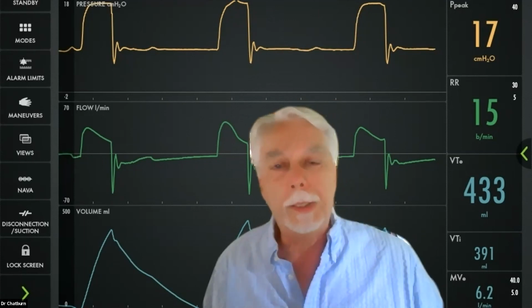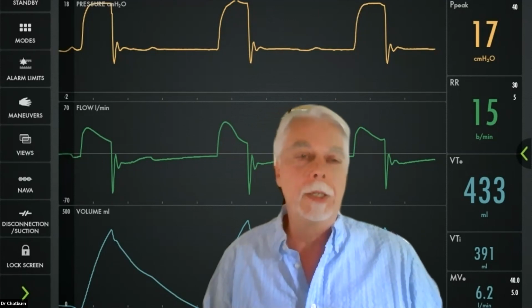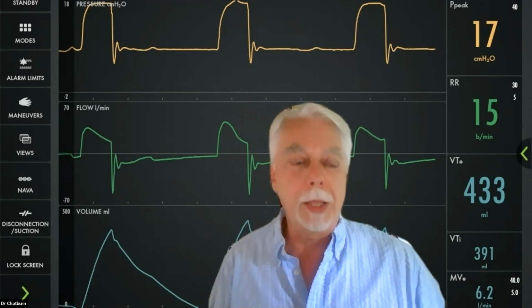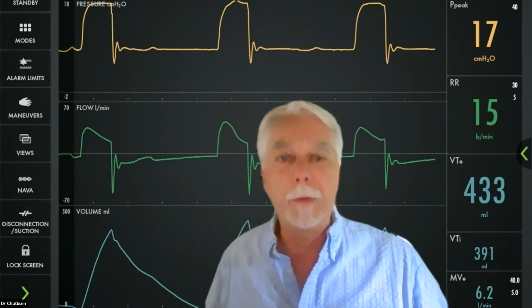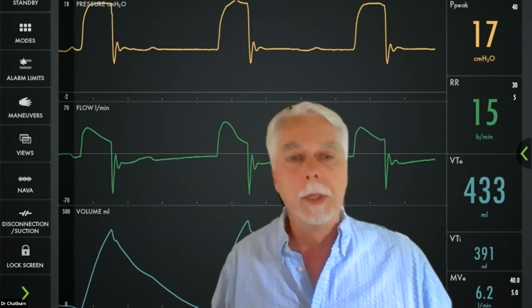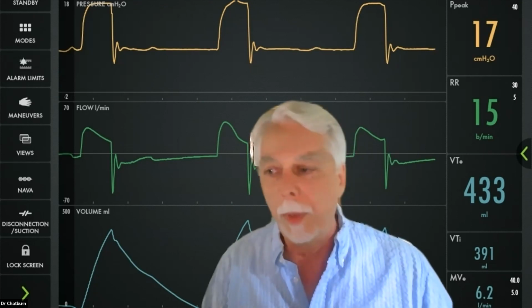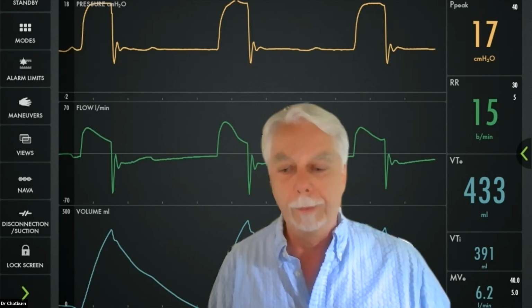The next best thing is to estimate alveolar pressure if you can estimate airway resistance, right? And there's at least one ventilator that has an algorithm for doing those things. How useful is that? I don't know. I would say that to the extent to which we have signals that represent muscle pressure, like NAVA or esophageal pressure, that is going to help us to fine-tune patient ventilator synchrony. And I think, again, because of the vast quantity of signals and how they change over time, we're going to have to rely more and more on automation and artificial intelligence to help us do that.